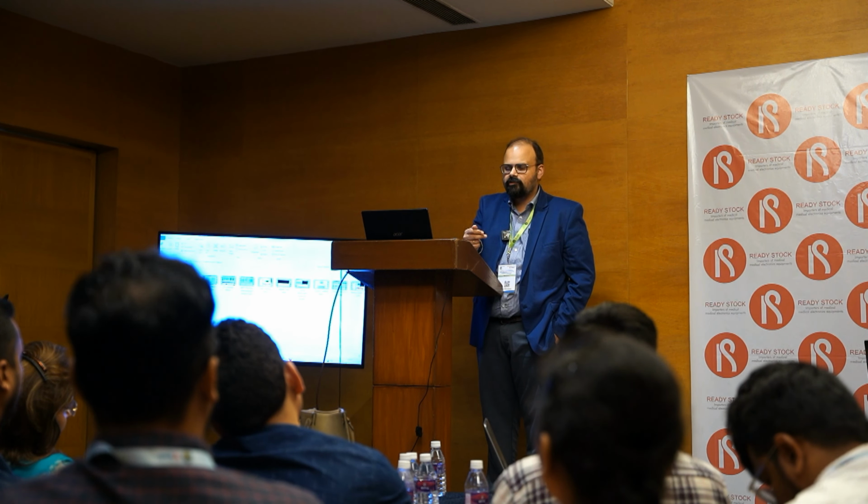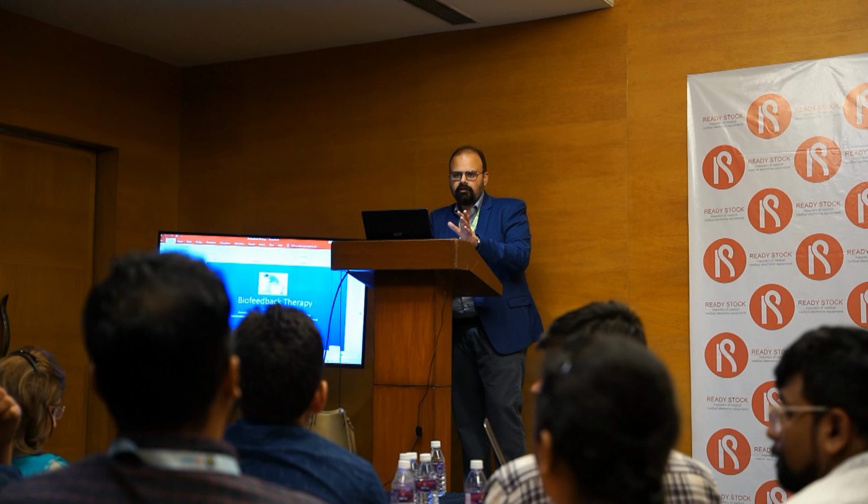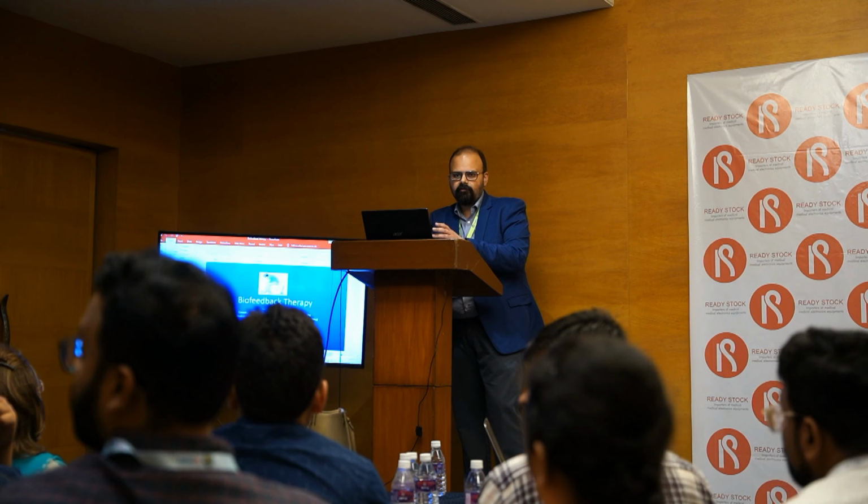Anything else? Yeah, please. Dyssynergia versus. So both are different entities. If you like, it depends on what clinical the graph, the video you mean. So how you work on the biofeedback when you get this abnormal balloon and abnormal push? Yes, I think the second part I will just cover quickly. Do we have some more minutes? Yes, yes. Can I cover the biofeedback also? I think that will answer your question also, ma'am, and that will answer your question also.